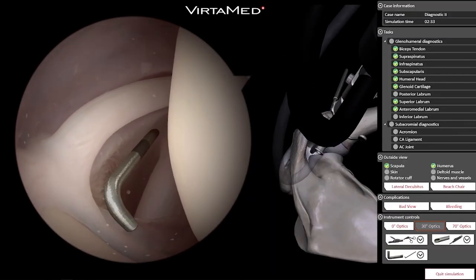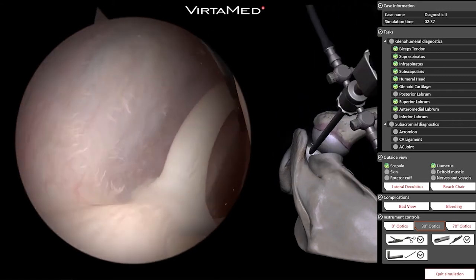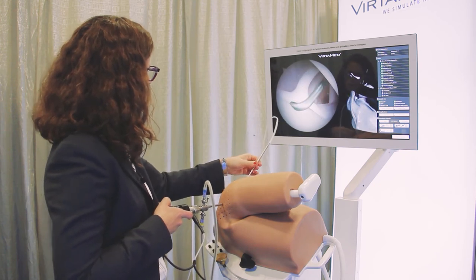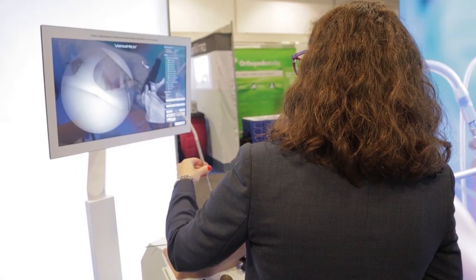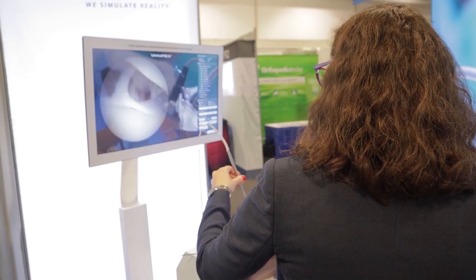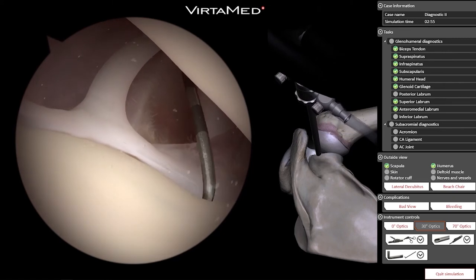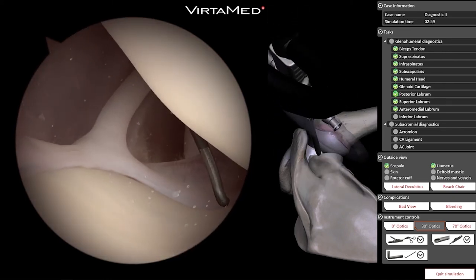I'm going to shift my view to look directly at the superior labrum. The biceps itself looks good, but the anterior labrum is definitely loose. I'd say this patient has a Bankart lesion, which is a tear of the anterior inferior labrum associated with shoulder instability. Otherwise, the rest of the joint looks good.